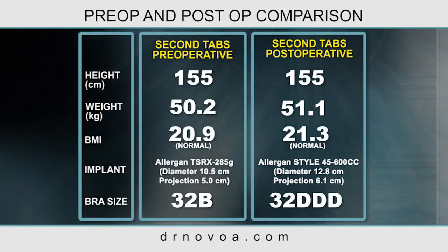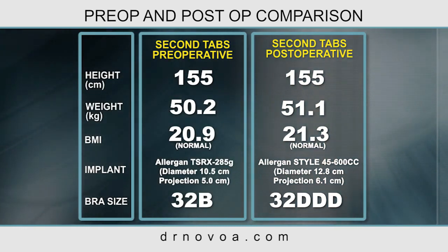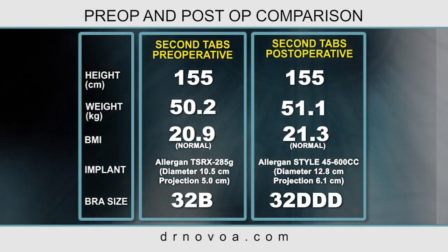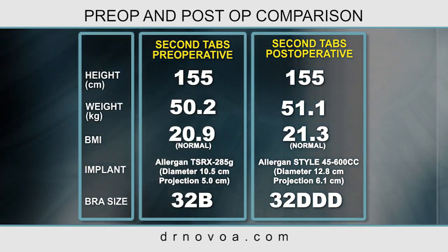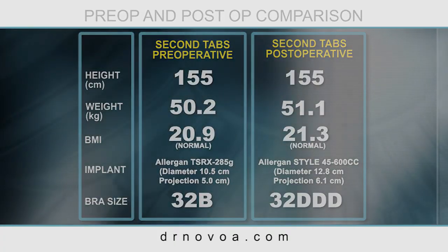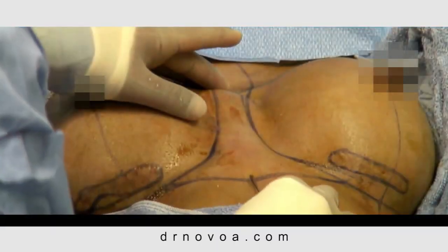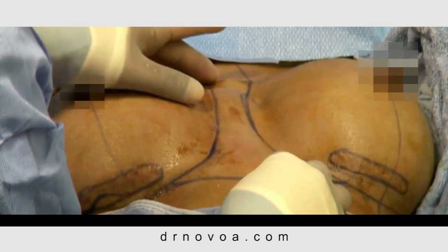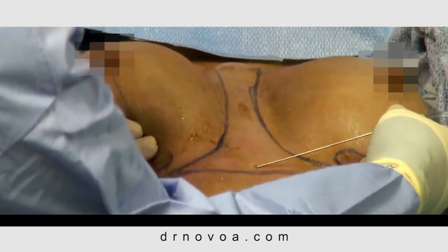During her second surgery, the patient opted to change from a 285-gram textured implant to a 600cc style 45, increasing her bra size from a 32B to a 32DDD. For intraoperative comparison, one breast is done at a time. Surgery begins with the infiltration of area 1, the mid-sternal line. Infiltration continues from areas 1 through 5.